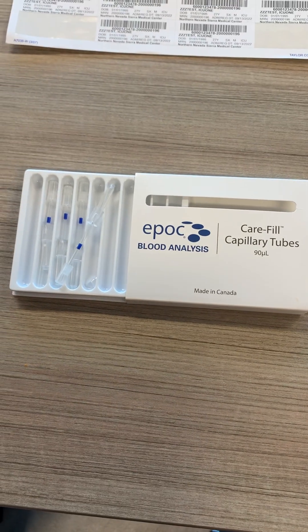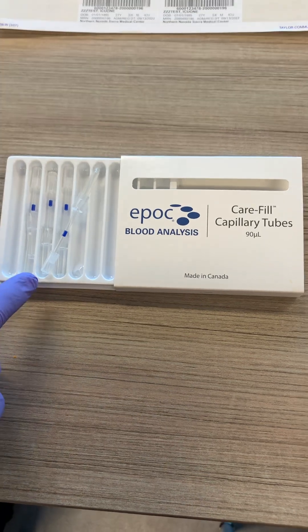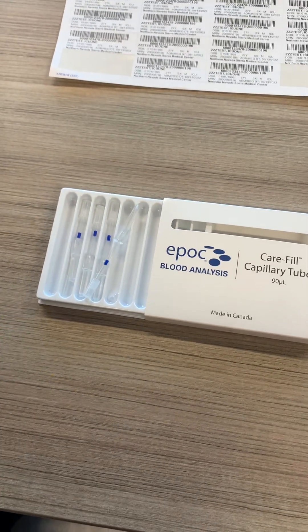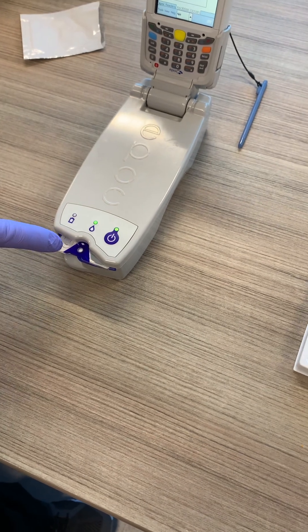We've got some new capillary blood tubes. We're going to do a quick video on how to use these, how to get the blood from the capillary tube to the EPOC unit itself, and the best way to insert it.